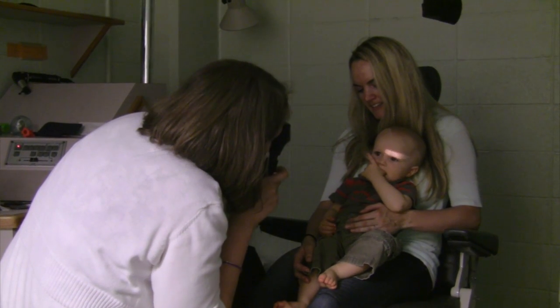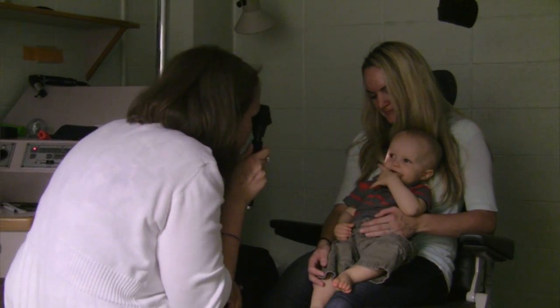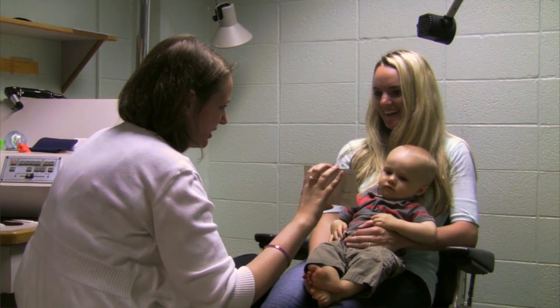After that we took a look at his eye alignment when we were shining the light. We're looking at the reflection of the light off the front of his eye — that looked perfect. We're also checking his depth perception. We have a card that has some 3D targets on it, and as you can see he grabbed right for them, so that was perfect.